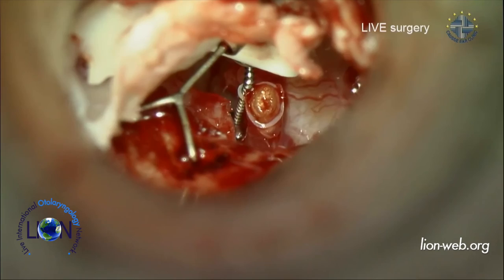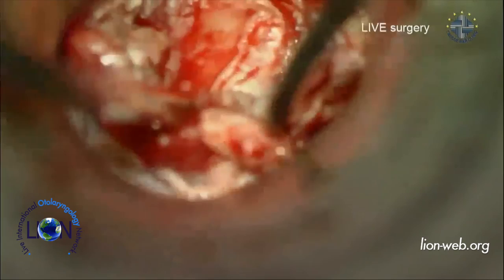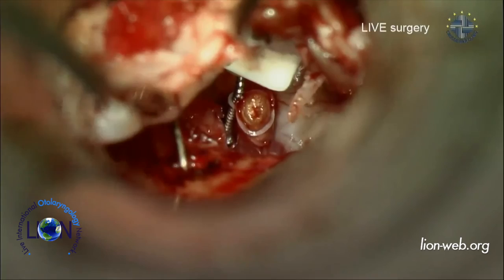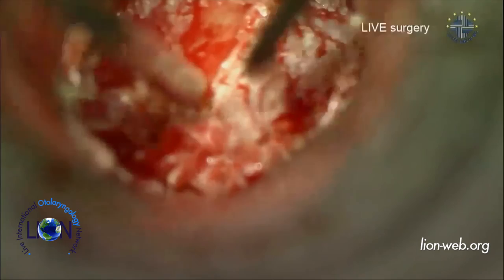Okay, so just placing now the cartilage and then replacing the flap. Je prends une lame de silastique, s'il vous plaît. I need to check again, just to be sure that everything stays in place, which is the case here. So it stays vertical and it's fine. So now just place the band, the silastic sheet, just to protect the tympanic membrane, and then we'll be fine.